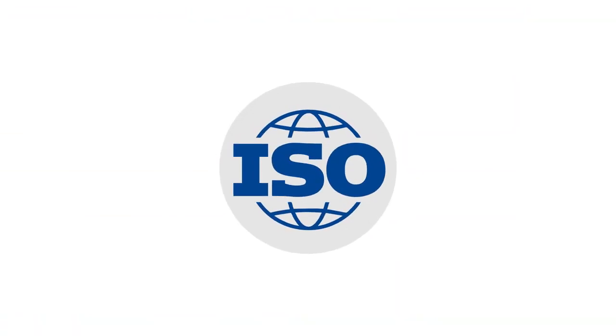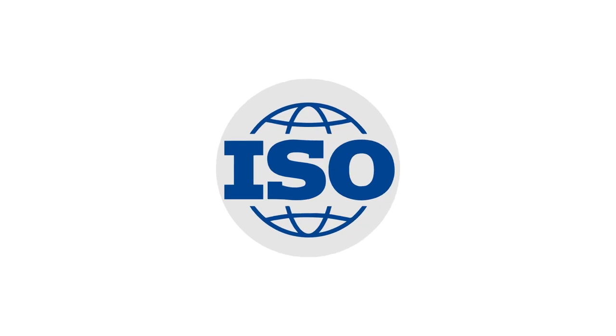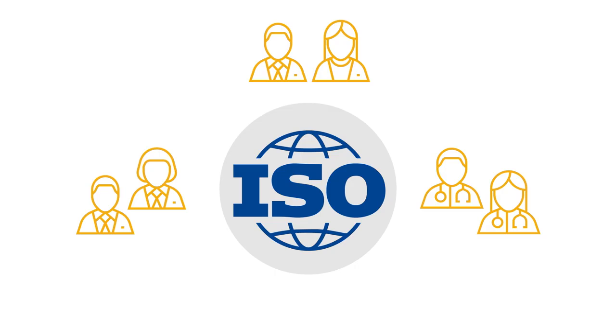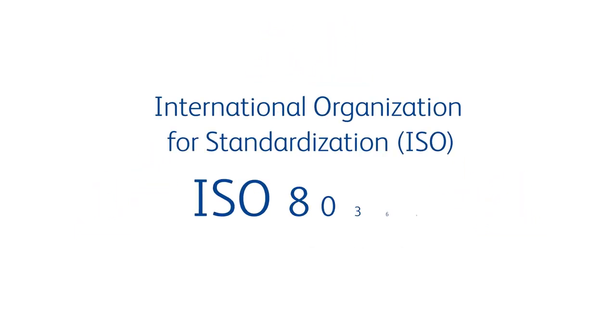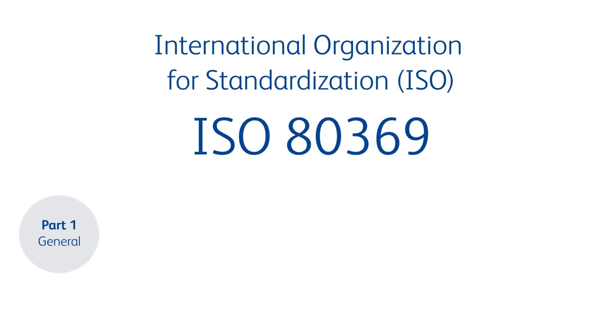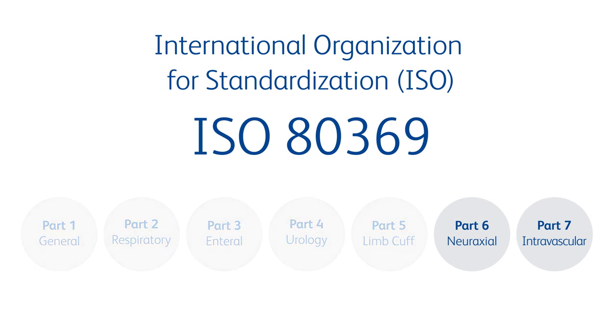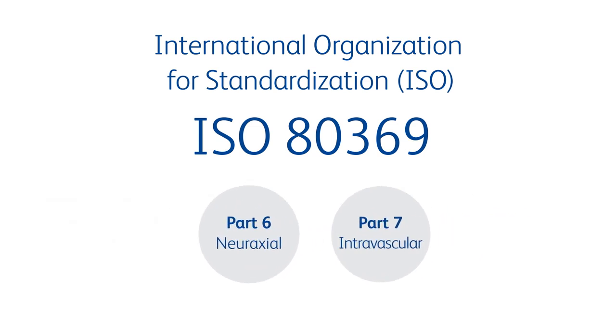Ten years ago, the International Organization for Standardization, or ISO, along with a group of manufacturers, clinicians, and regulators, began work on reducing the risk of misconnections between two unrelated patient delivery systems. The result of that effort is ISO 80369, a series of design standards for small bore connectors designed to improve patient safety and reduce the risk of misconnections. BD has supported this initiative from the very beginning and is specifically involved with Part 6 and 7. This sweeping standard provides connector design requirements across many healthcare applications.